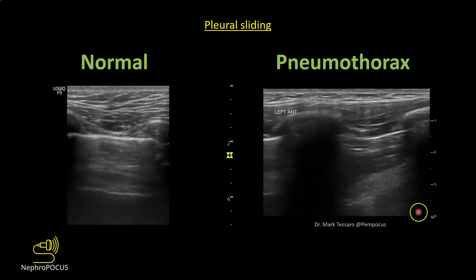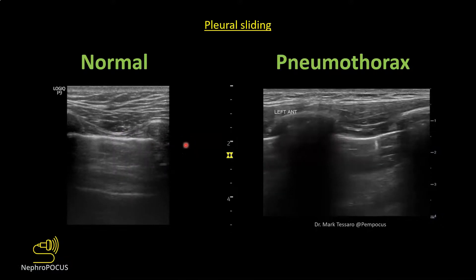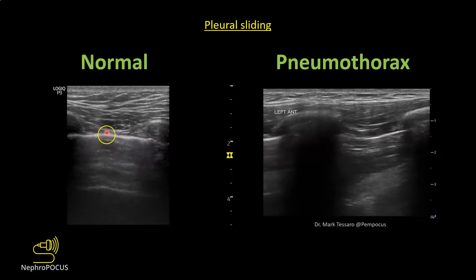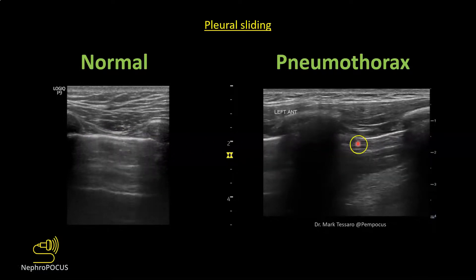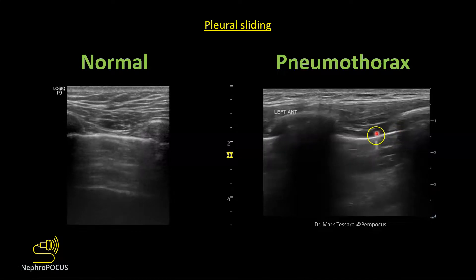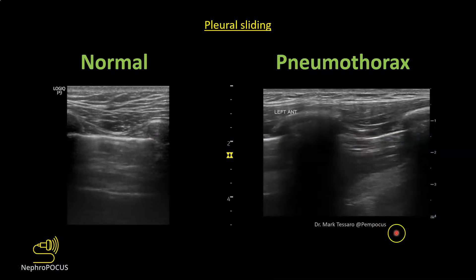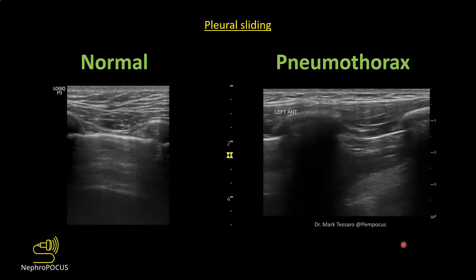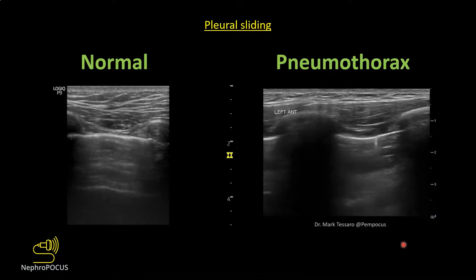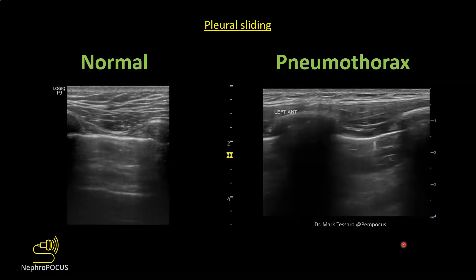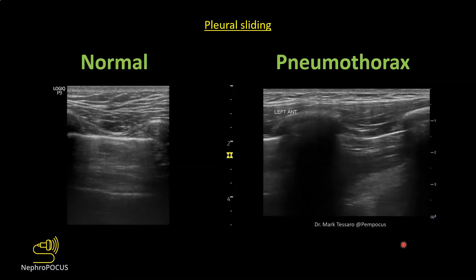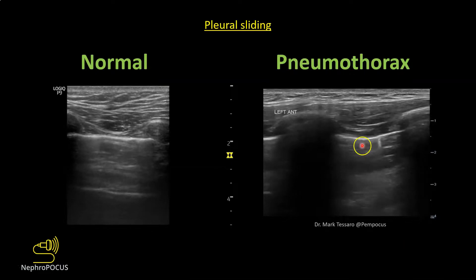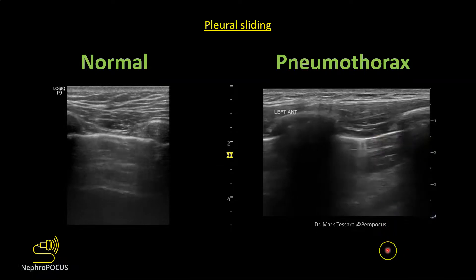Pleural sliding is important to know because absent pleural sliding can signify pneumothorax. In normal sliding lung you see a nice shimmer of the pleural line. The lung point is the junction between non-sliding and sliding lung and is very specific for pneumothorax. If you rely only on absent sliding, note that a patient who is not breathing will also show no shimmering; when you see the junction of normal and abnormal lung, that is definitely significant for pneumothorax.